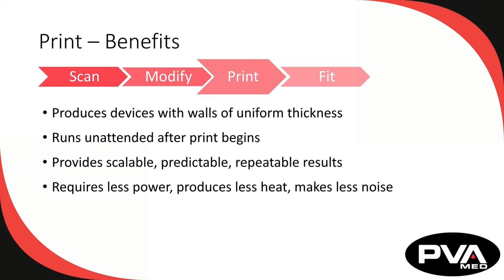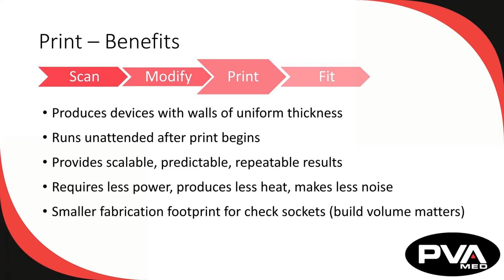In addition to business benefits, there are environmental and workplace benefits. Fabrication through 3D printing requires less power, produces less heat, consumes less material, and makes less noise than traditional fabrication workshops. Fabrication footprints can be reduced from an entire workshop room or rooms to less than the space required for a refrigerator. With sufficient build volume, a characteristic of 3D printers, devices for most above-knee and below-knee patients can be automatically fabricated.